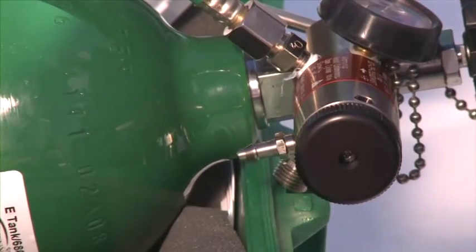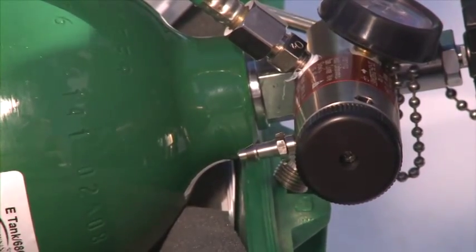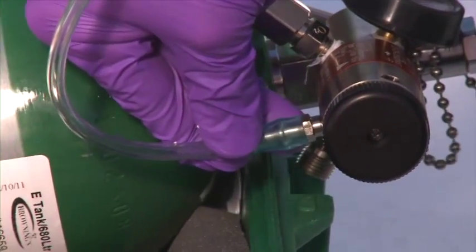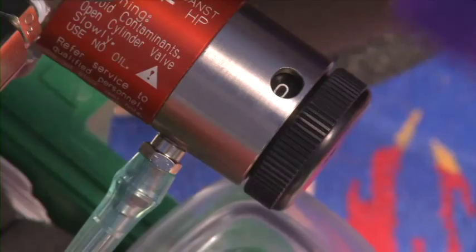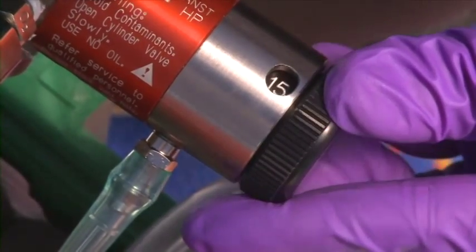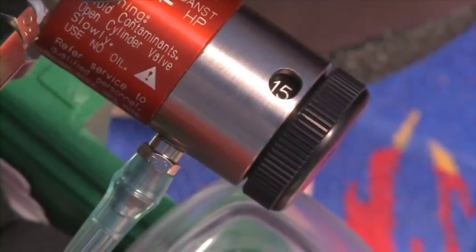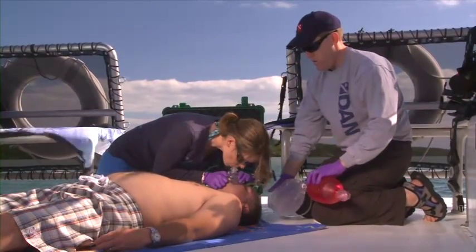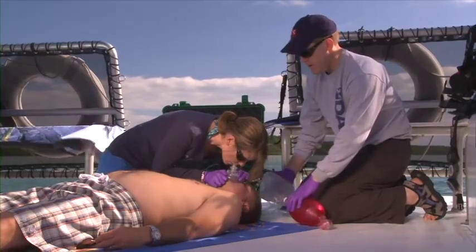To prepare a BVM, use connecting tubing to attach an oxygen delivery system capable of delivering a high flow rate of oxygen. Set the flow rate controller on the regulator to 15 liters per minute. Listen for the flow of oxygen into the device and allow the oxygen reservoir to completely fill.